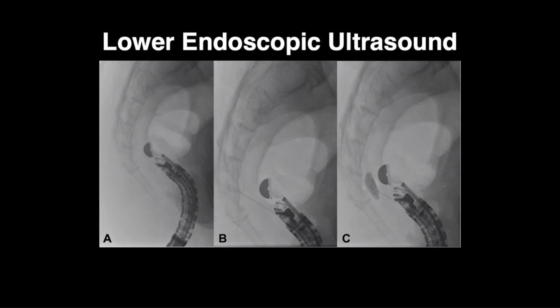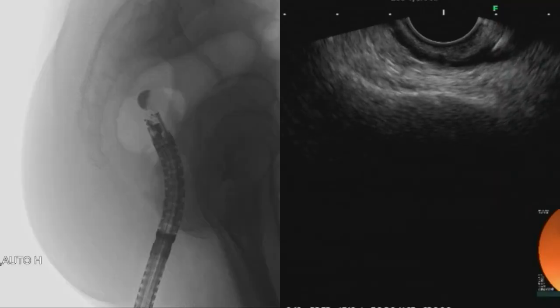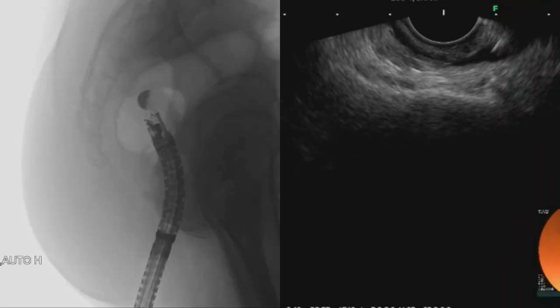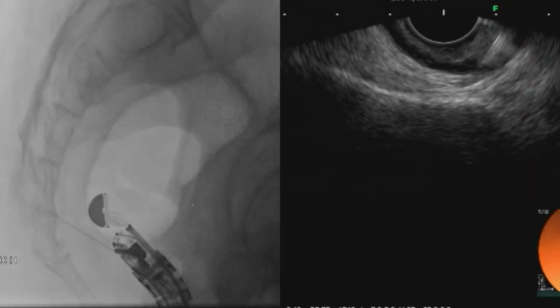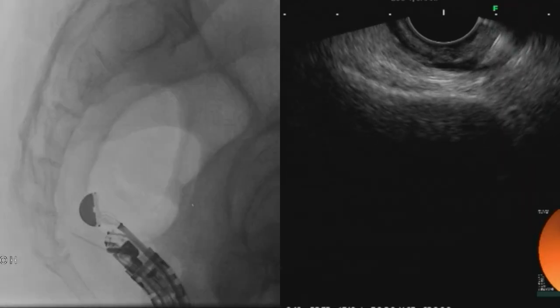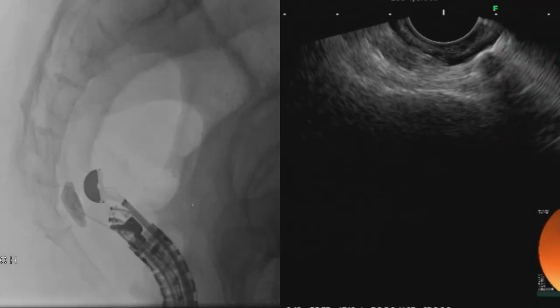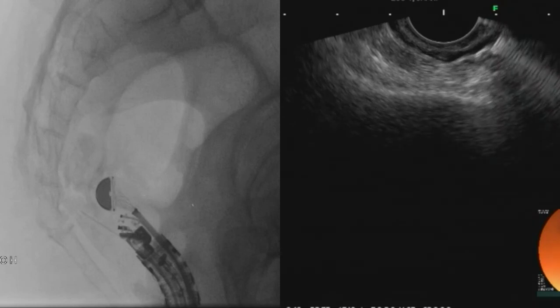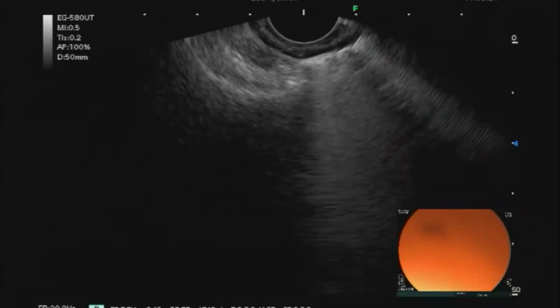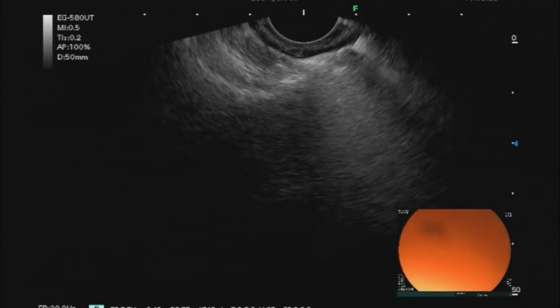The lower echo endoscope and 22-gauge needle are visualized on fluoroscopy during the procedure. Under echo-endosonographic guidance, the 22-gauge needle is gently advanced to the sacrum, followed by gradual withdrawal so that the tip of the needle terminates within the pre-sacral space. Once needle positioning is confirmed, the mixture of normal saline, local anesthetic, and triamcinolone are injected into the pre-sacral space near the location of the ganglion impar.